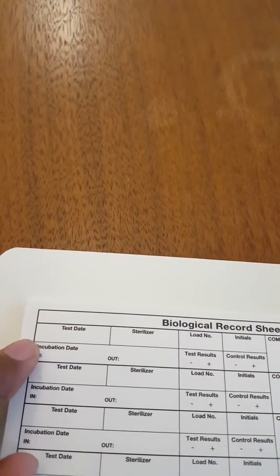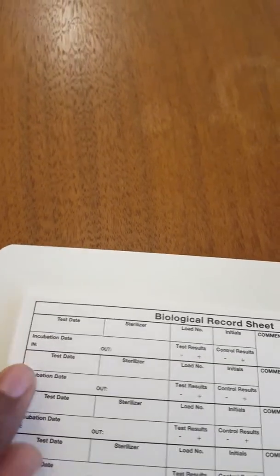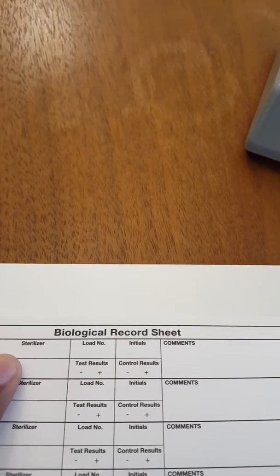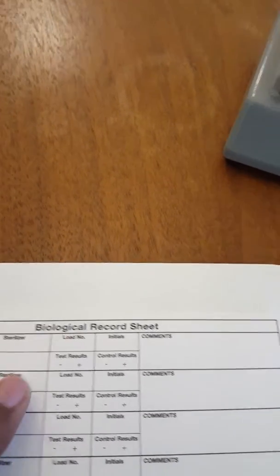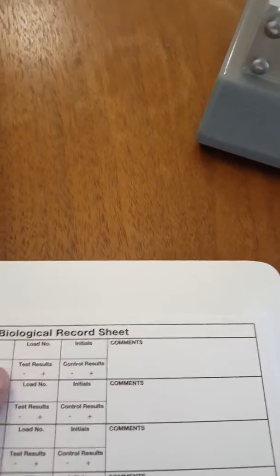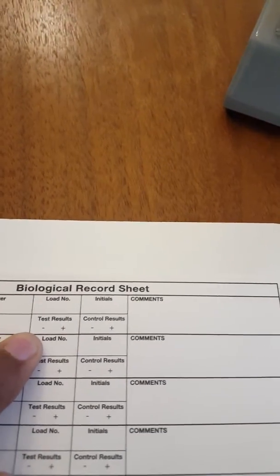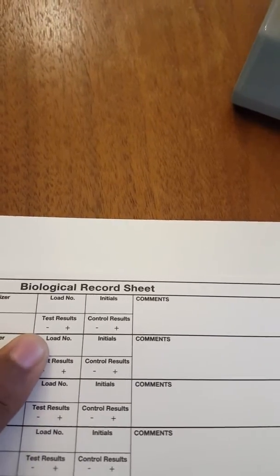Once the test has been confirmed, we want to record the results. The first thing we want to do is put the test date, the incubation time, when it was put inside of the incubator, when it was brought out, and then record which sterilizer. Of course, I have two sterilizers upstairs, so I have 2 different ones. The load number, and then you want to record on the one that was placed in the autoclave, how did that show up, negative or positive, which of course this one showed up negative.